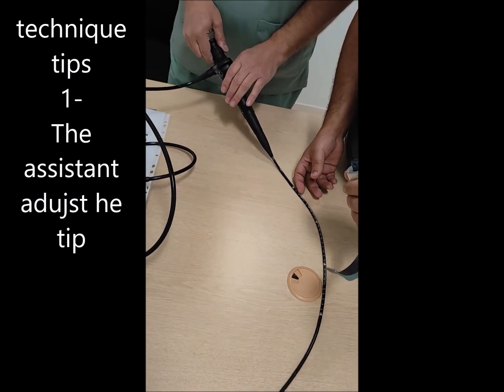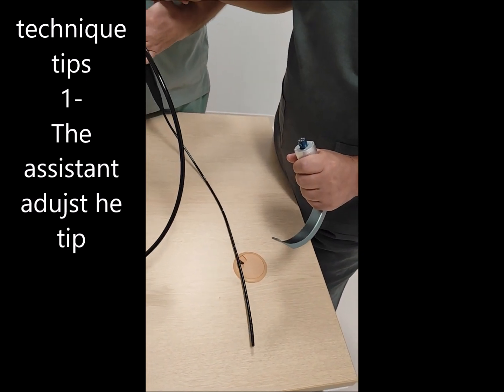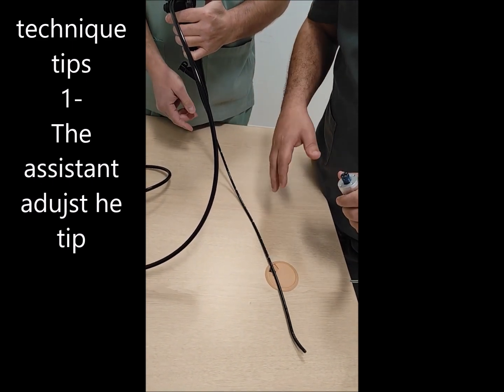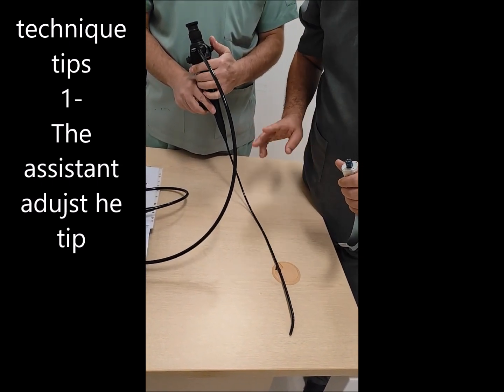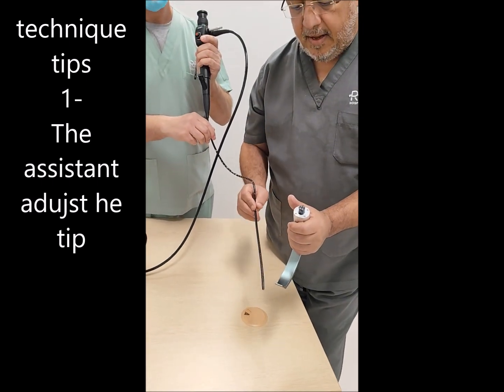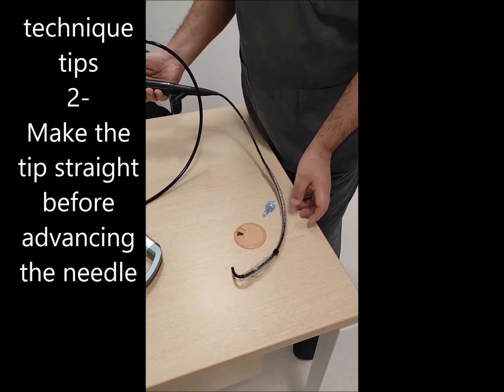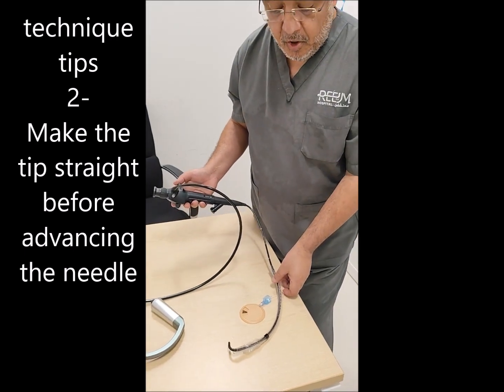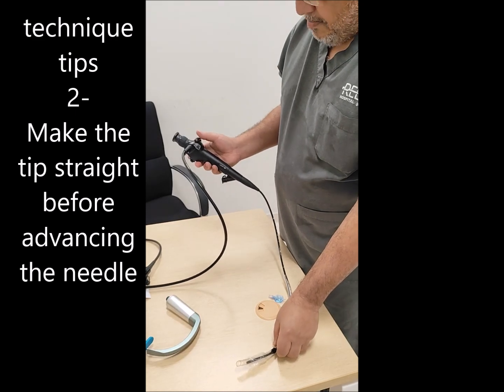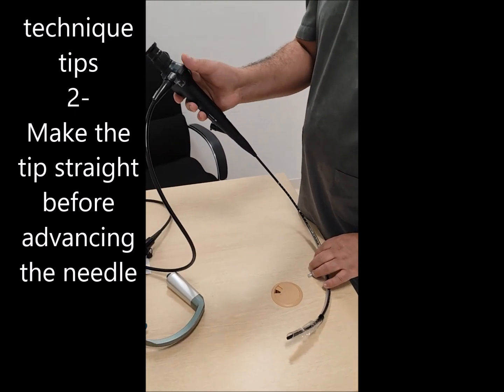One point about the fiber optic technique is that it also requires three hands: one for holding the glidescope, one for advancing the shaft of the fiber optic, and one to adjust the controller or lever of the tip. In practice, the assistant adjusts the tube and tip direction while the operator holds the laryngoscope and advances the fiber optic, with the assistant moving it up or down based on what is seen in the glidescope camera. Importantly, before advancing the tube, you must ensure the lever makes a straight alignment — if the tip is kinked in any direction, the tube will not pass.